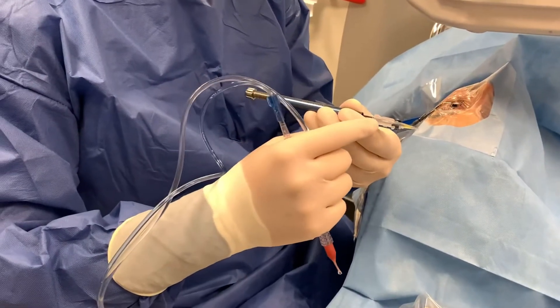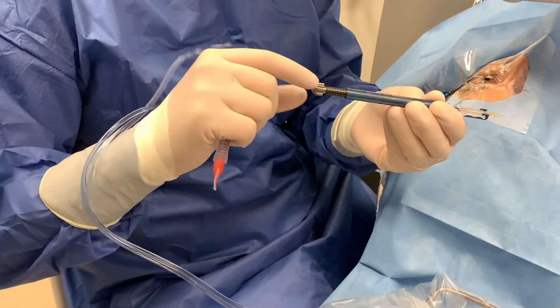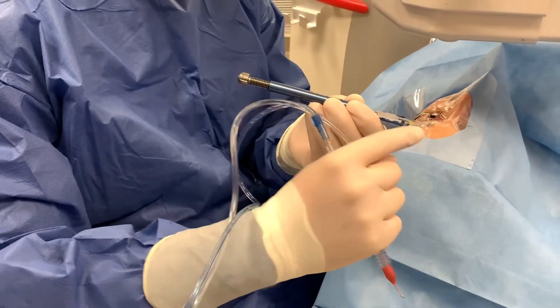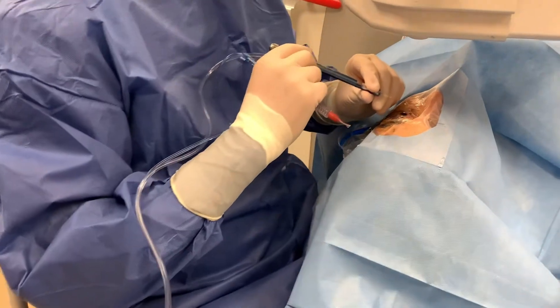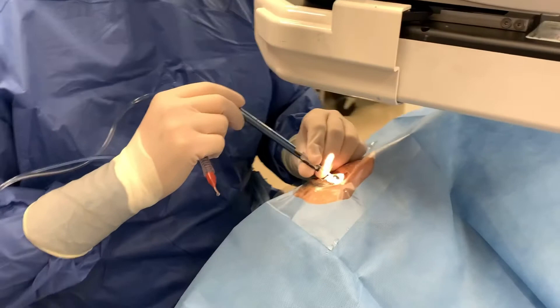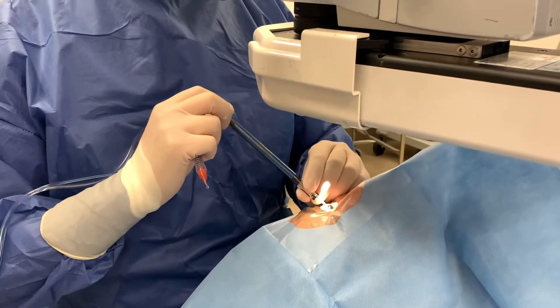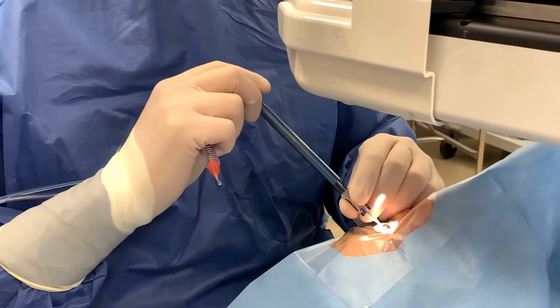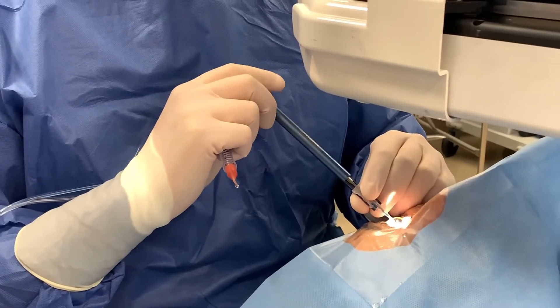With the older delivery system, you have the cartridge, the lens, and then the delivery module. There's a screw here that we use to spin, which will press forward and advance the lens implant. Notice when I do this, I have to use two hands — one hand holding the cartridge and the other hand pressing that swivel — and now we have the full delivery of the lens.